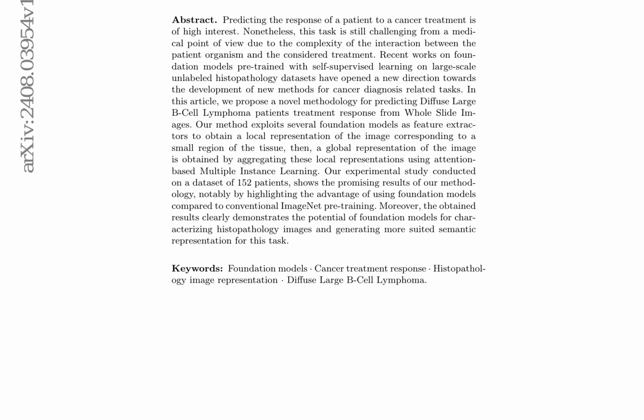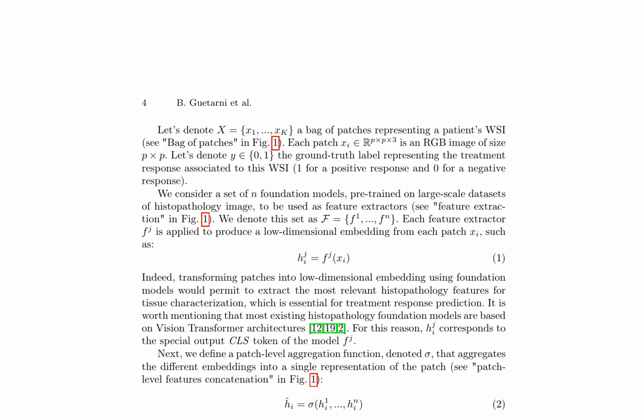This approach emphasizes the potential of foundation models for characterizing histopathology images and generating more suited semantic representations for this task. The research paper formulates the task as a binary classification problem, where the goal is to predict the treatment response based on the patient's Deauville score. The proposed method utilizes multiple foundation models, pre-trained on large-scale histopathology datasets, as feature extractors to produce low-dimensional embeddings from patches of the WSI. These embeddings are then aggregated using a patch-level aggregation function, defined as the concatenation operation, to create a single representation of the patch.